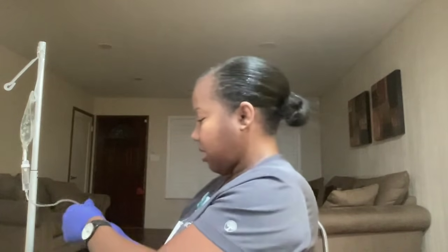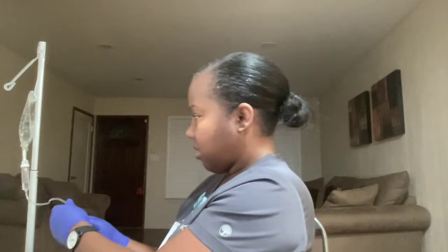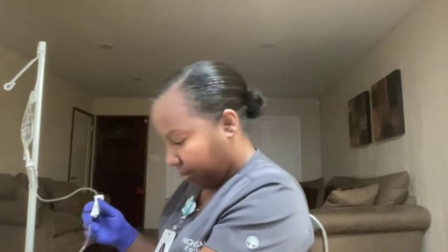Okay, so I did verify that there were 38 drops for that 1 minute.